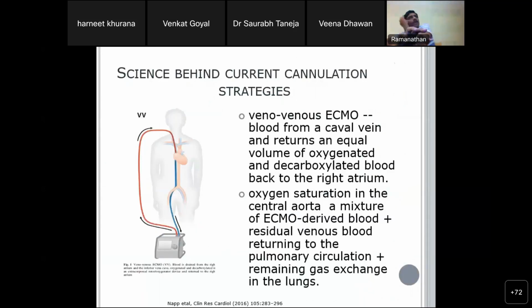Okay, sure. To start off with, I think it's prudent if we start talking about the science behind the current cannulation strategies. This is an ELSO meeting, and you are all familiar with what ECMO is. So I don't have a big problem convincing you about the science behind veno-venous ECMO and how oxygen exchange happens in a veno-venous ECMO circuit.